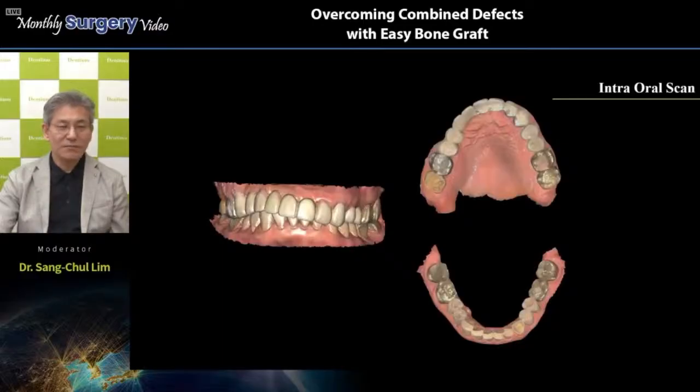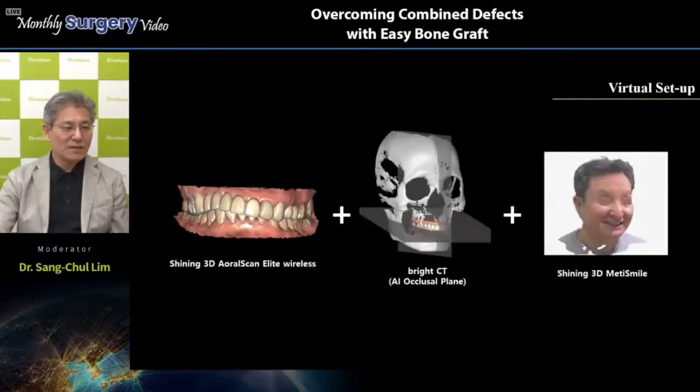Intraoral scan here, the pre-op scan. As you can see clearly, in the upper anterior, the occlusal scheme is good. I don't think so. There is a big discrepancy and curvature and a non-aesthetic situation. So the patient also needs a little bit of correction for this uncomfortable and unaesthetic situation. So finally, he has decided to have an implantation with the new processes.